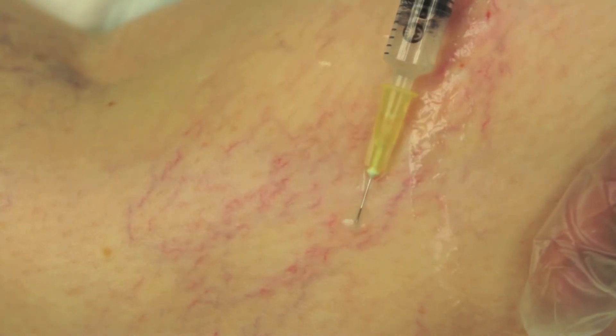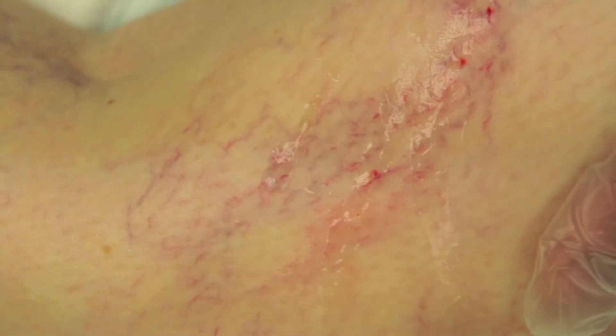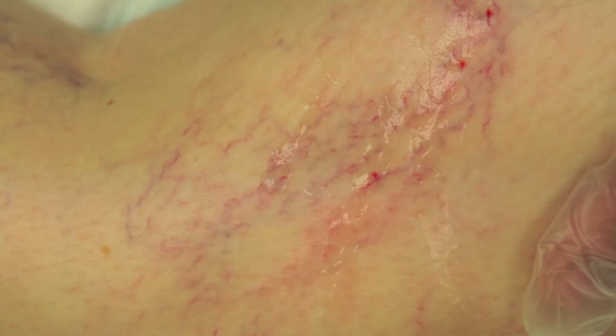It is important to inject small volumes of sclerosant under low pressure. As the blood returns to the veins, they look inflamed.